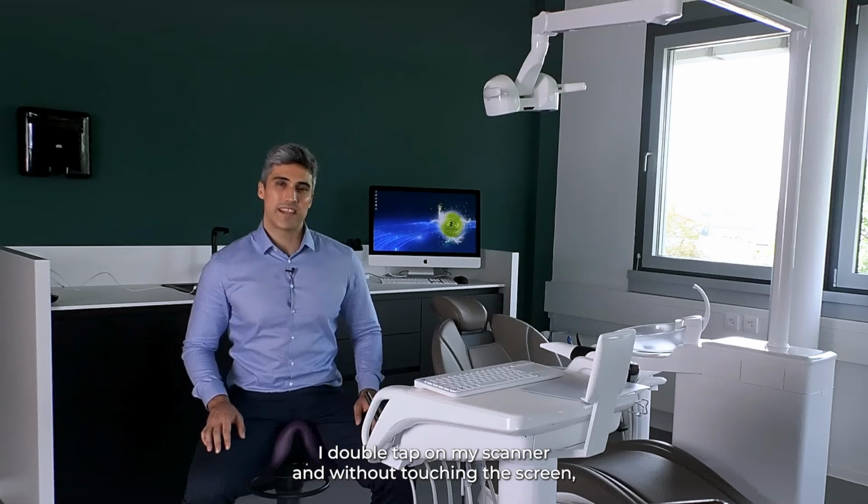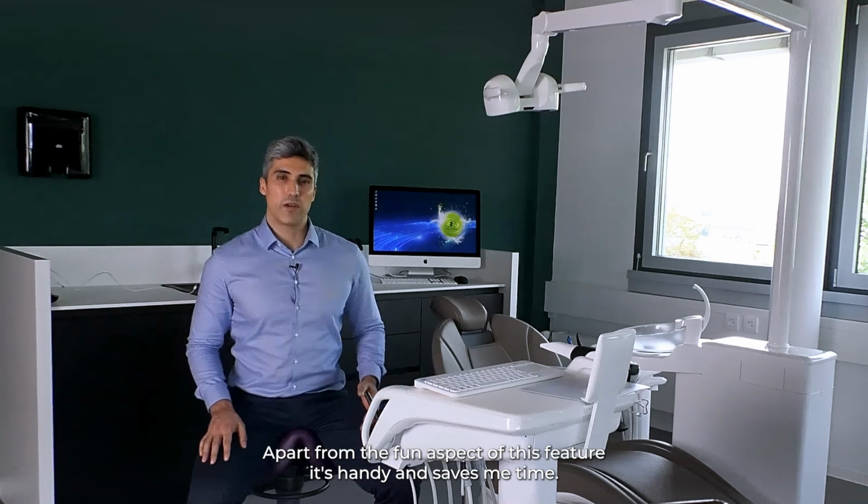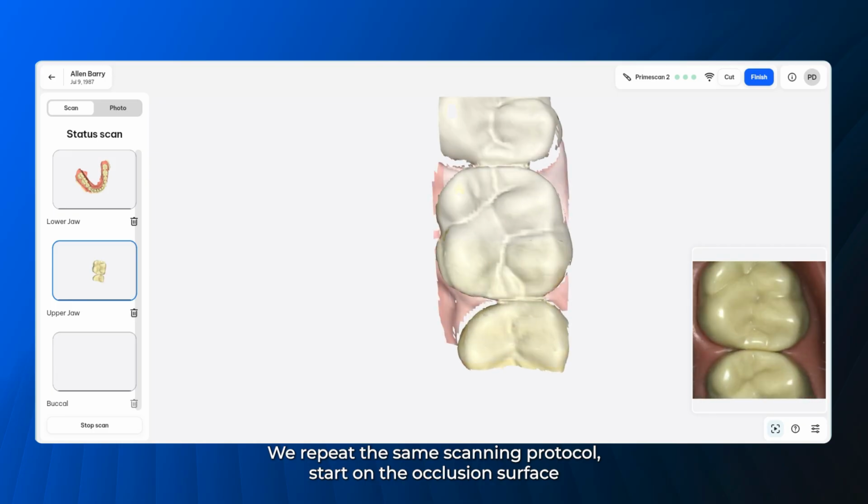I double tap on my scanner, and without touching the screen, I can now move directly to the next catalog. Apart from the fun aspect of this feature, it's handy and saves time. We repeat the same scanning protocol.